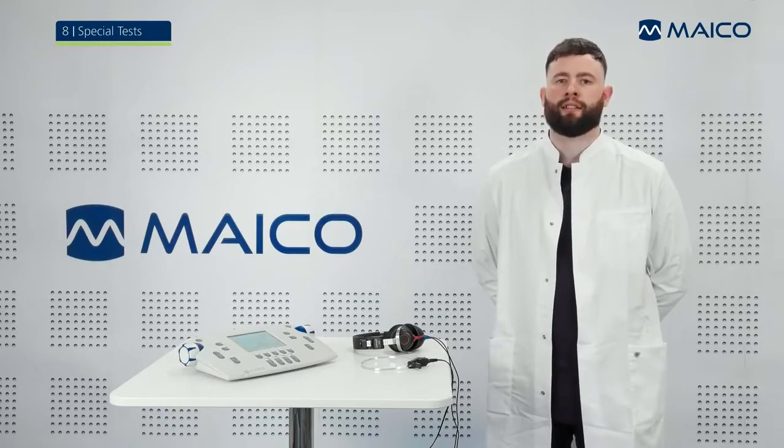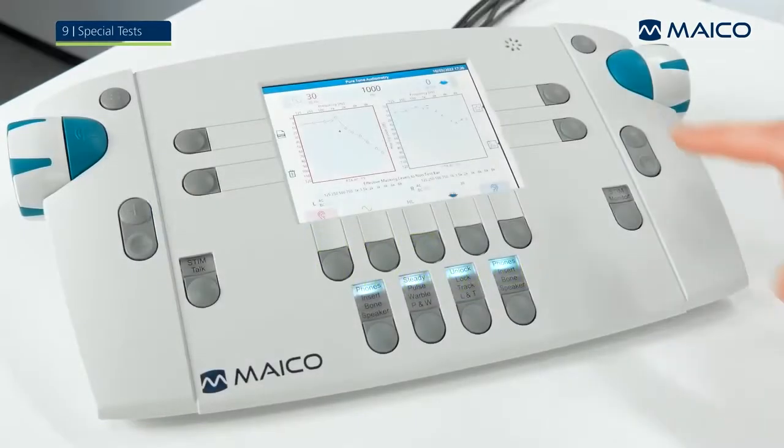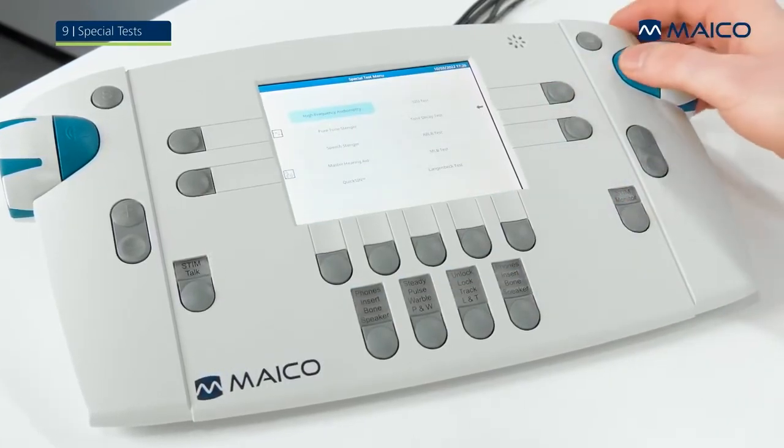The MA42 has various special tests which are accessible through the special test menu. Some tests are available for free, others are available with purchase licenses. Select the high-frequency audiometry from the special test menu.